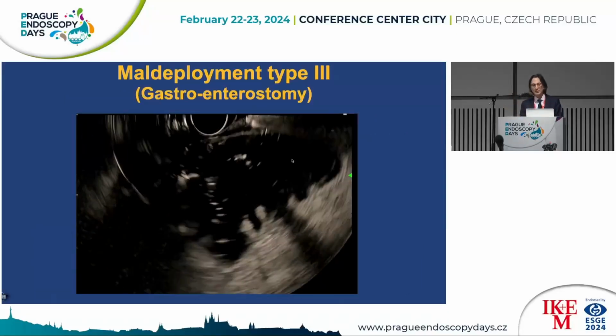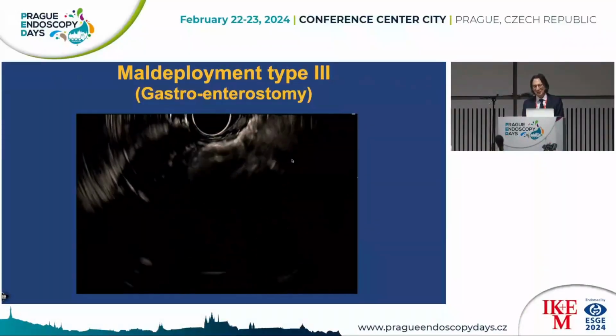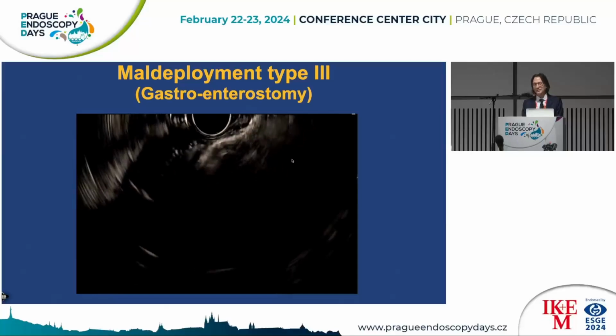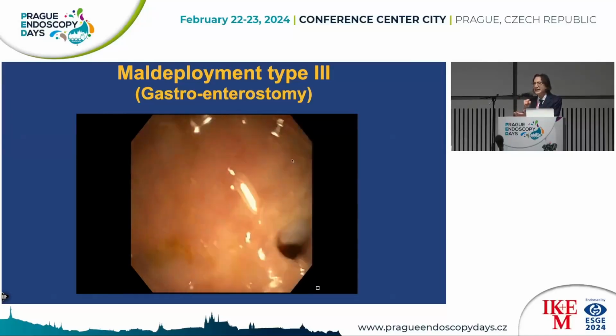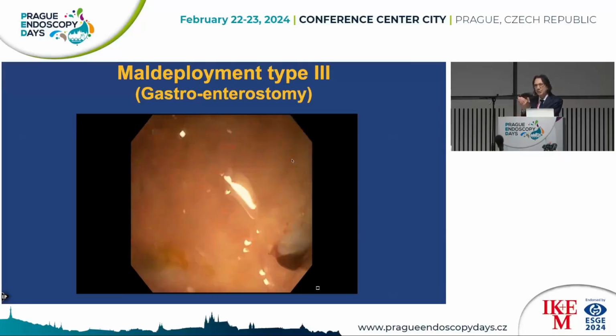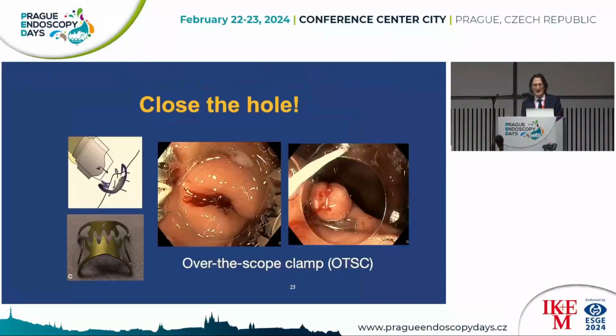And this is a video of a case a colleague of mine did in my unit. He's learning this, and he learned from this mistake. You can see he snugged up very nicely. He's ready now to switch to the endoscopic view. But when he pushed out, he did that too rapidly without waiting to see that proximal flange open up, and he pushed that proximal flange through the stomach wall into the peritoneal space. And this patient had to go to surgery because you have drainage freely into the peritoneal space.